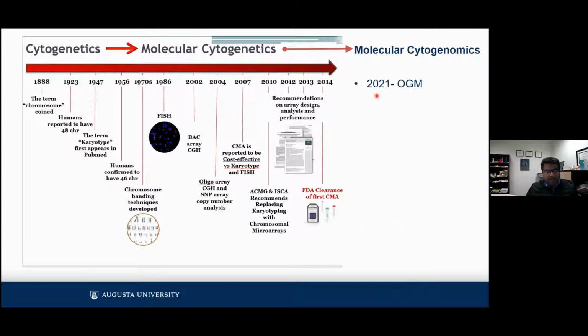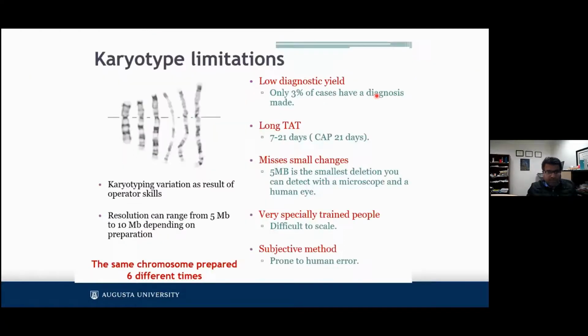Yesterday, I think you heard about the heme malignancies, and today we're going to focus mostly on how we can use optical genome mapping on solid tumors.